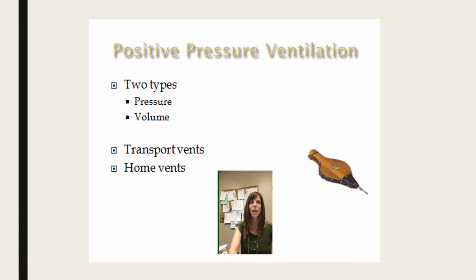Okay, we're going to start talking about positive pressure ventilation. So far we've talked about negative pressure ventilation, and we've somewhat talked about positive pressure ventilation. Whenever you push air into the lungs, that's positive pressure ventilation. So whenever you are bagging your patient, you are using positive pressure ventilation. When we were working with the compliance and the raw exercises, you were using positive pressure ventilation.